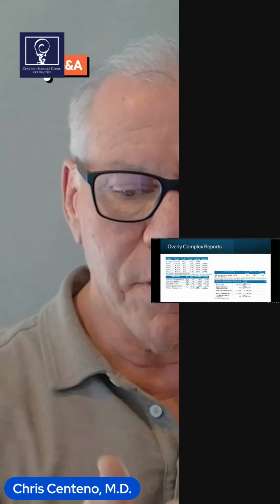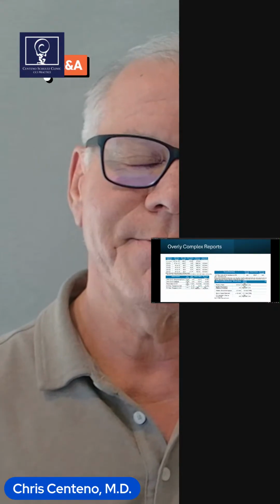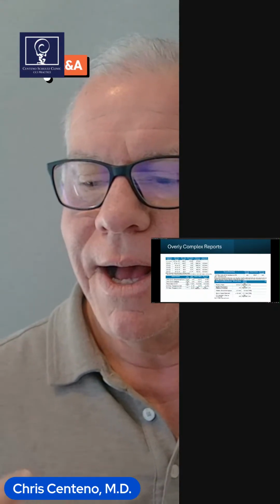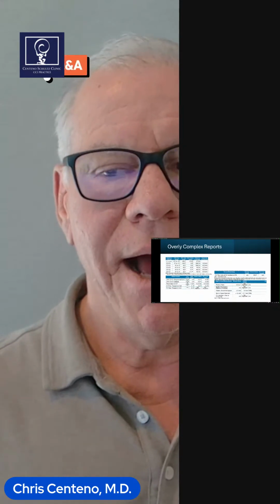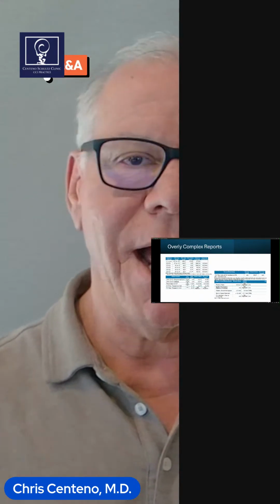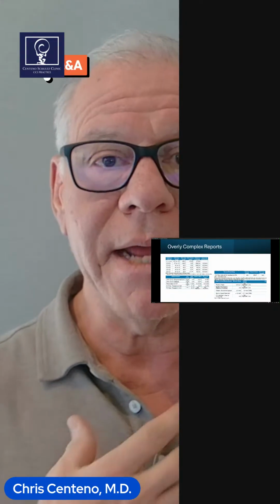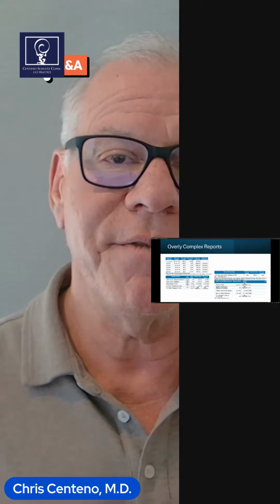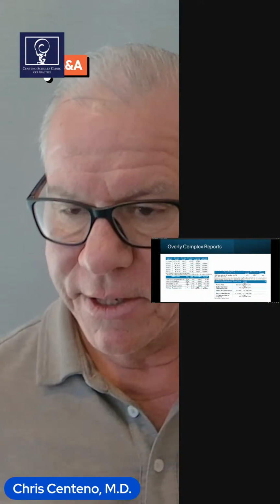Sometimes it's measuring rotation. Sometimes it's measuring obscure measurements like a Powers ratio or Chamberlain's line, etc. Again, with all of this stuff, there's maybe a few numbers in here that are important for me to make a diagnosis. The rest of it is fluff, right? The rest of it is not actionable, and it's overly confusing to patients.